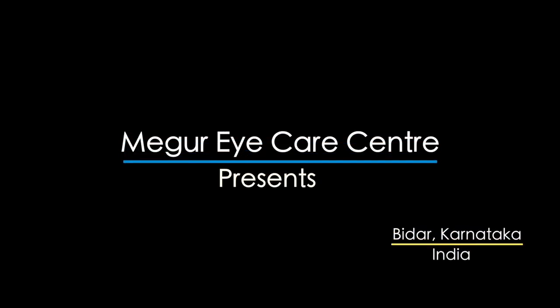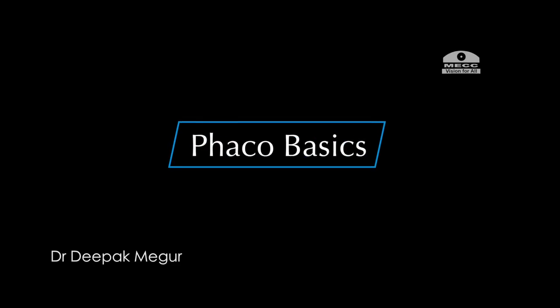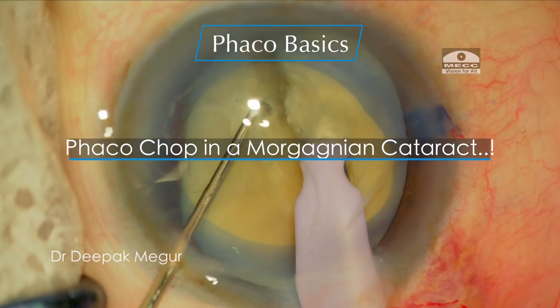Hi friends, today I want to highlight and share some practical tips while dealing with a hard nucleus in a Morgagnian hypermature cataract.